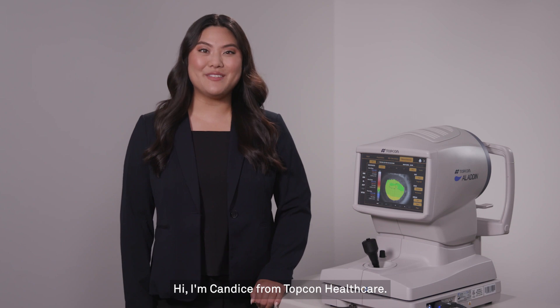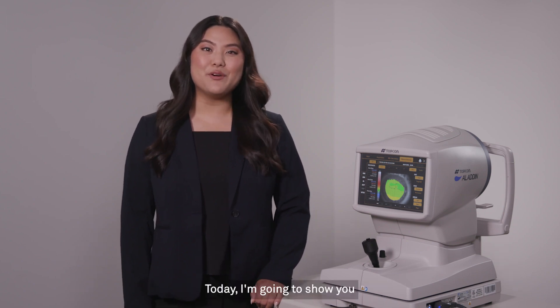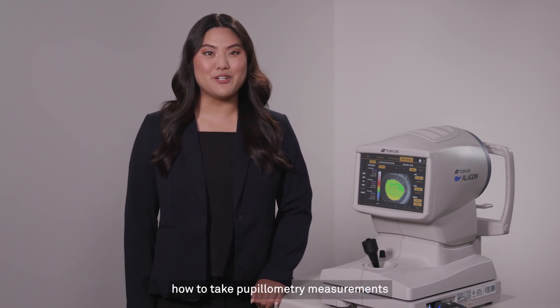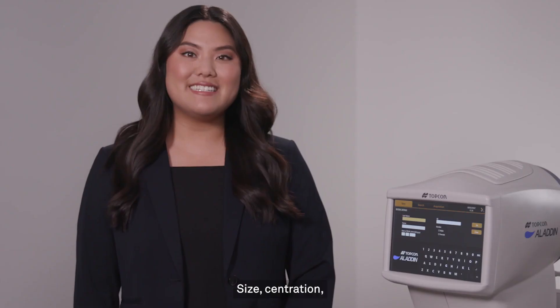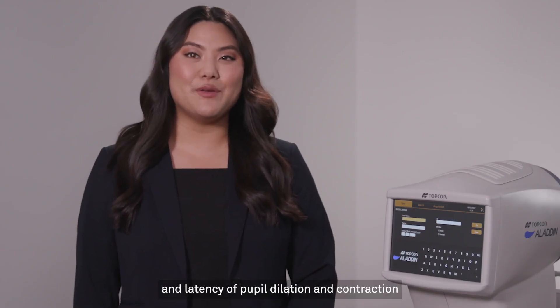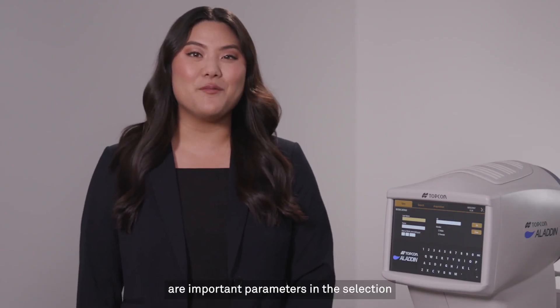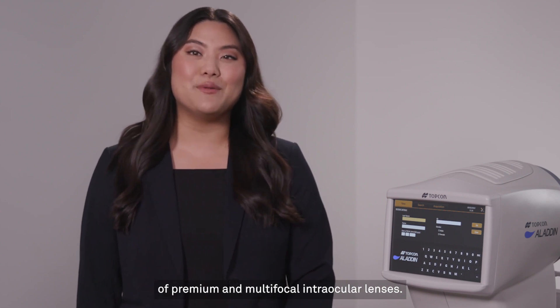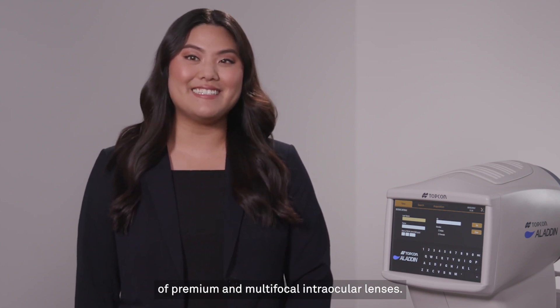Hi, I'm Candice from Topcon Healthcare. Today, I'm going to show you how to take pupillometry measurements using the Aladdin. Size, centration, and latency of pupil dilation and contraction are important parameters in the selection of premium and multifocal intraocular lenses.